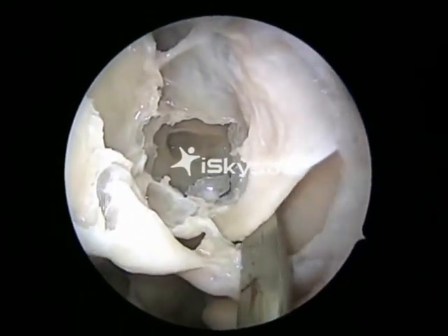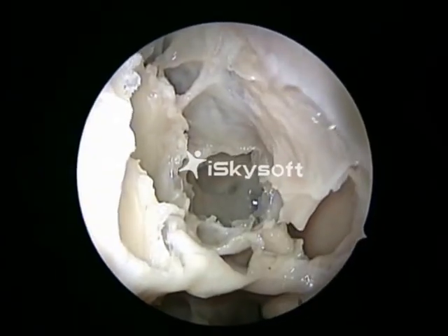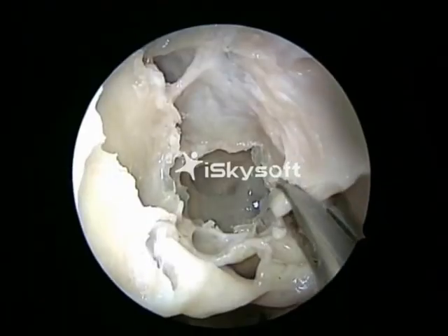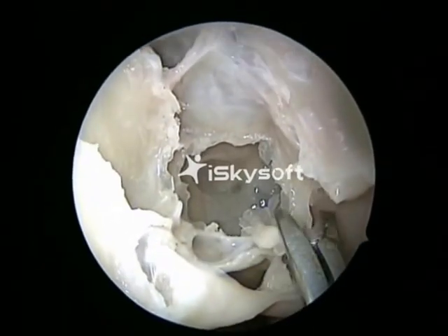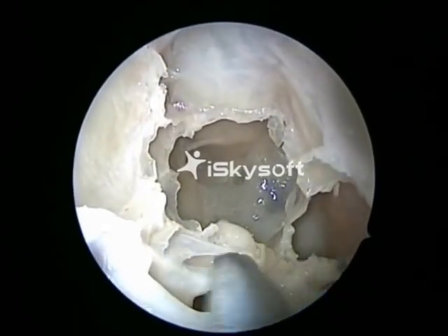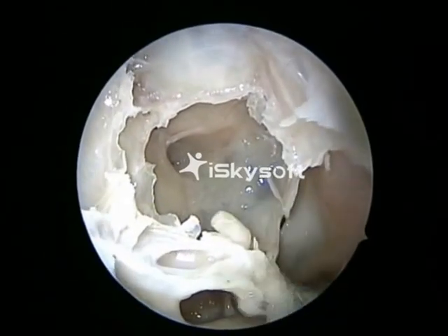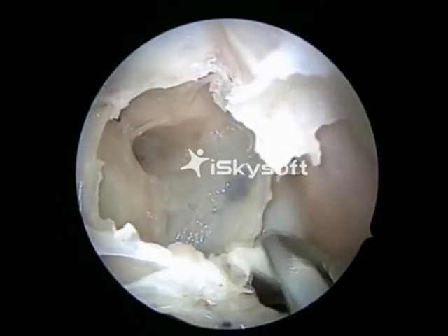A Freer's elevator is used to gently push it laterally. The inferior third of the superior turbinate is punched out using a Karl Storz true cutting forceps. It is advisable not to take the whole of the superior turbinate, but just the inferior third of the superior turbinate.